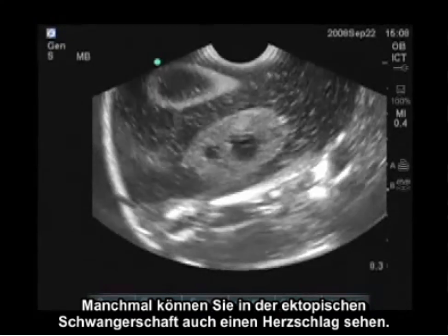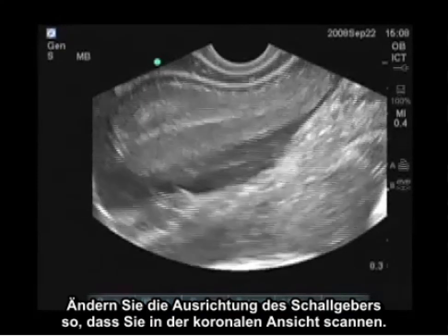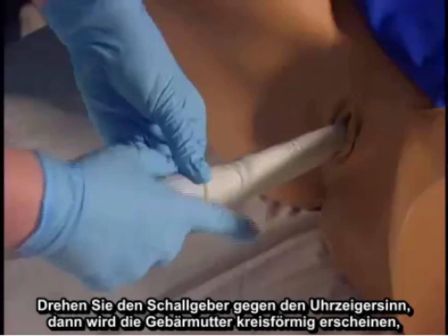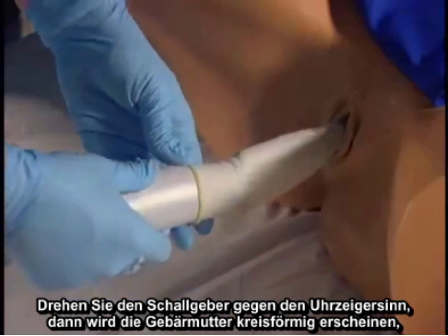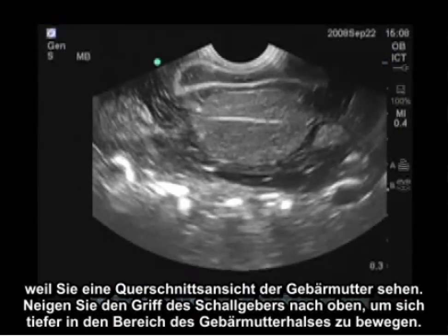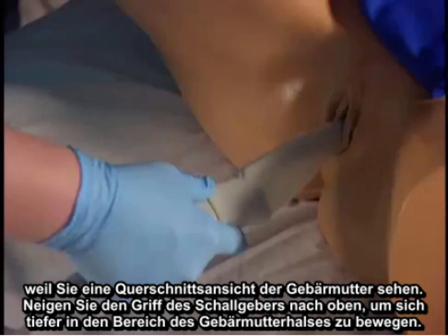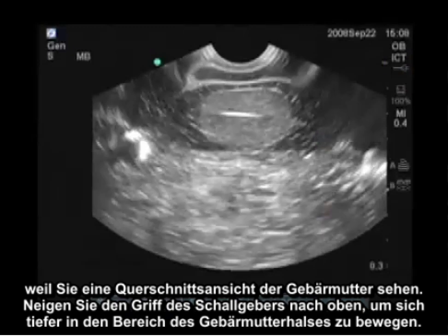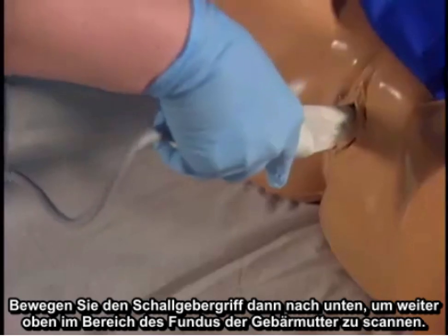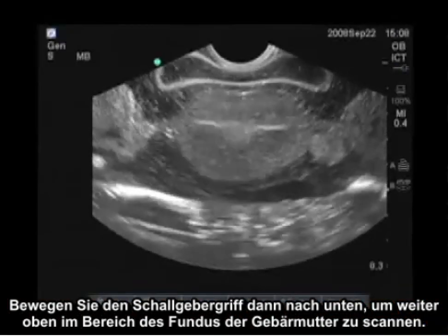Now I'm going to change the orientation of the transducer to a coronal view by turning the transducer counter-clockwise. The uterus will appear circular because we're cutting a cross-sectional view of it. I tilt the handle up to move inferiorly down into the region of the cervix, then bring the handle down to scan superiorly into the area of the fundus. In this case, I can see there's no pregnancy inside the uterus itself.